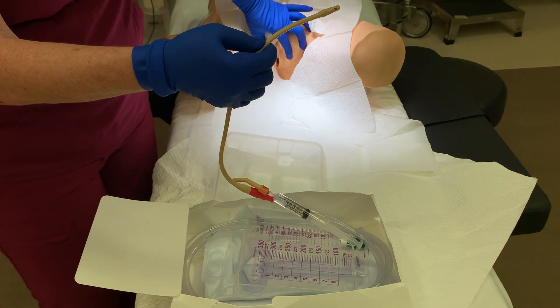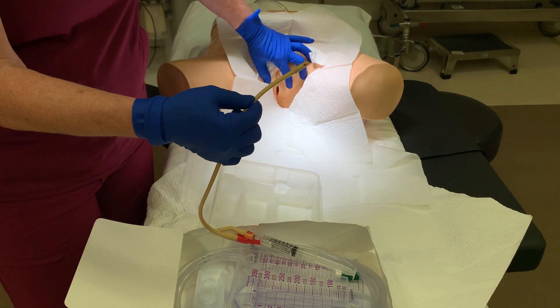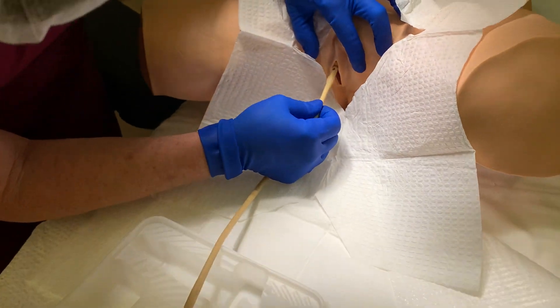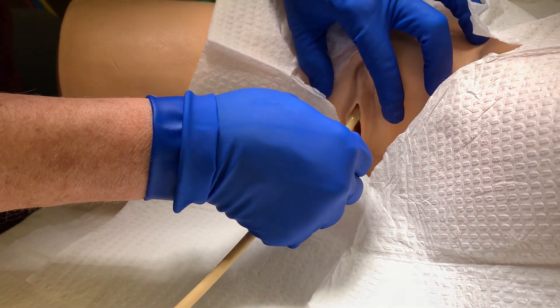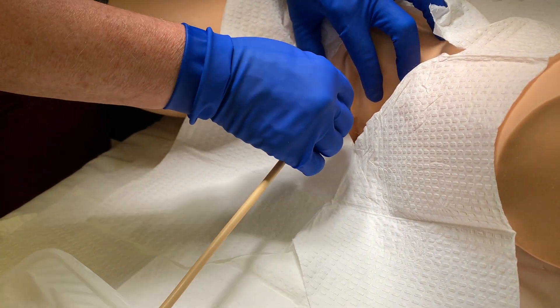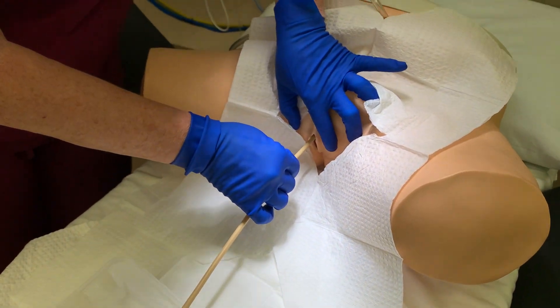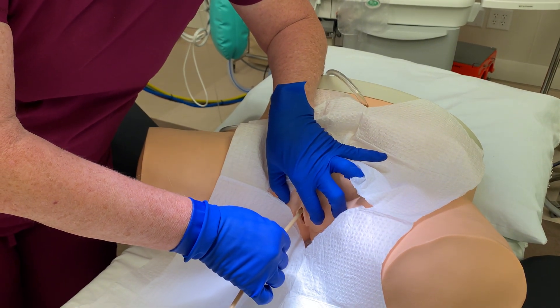My hand does not move. The next thing is to advance the catheter. The female urethra is shorter than the male, so you only need to advance this catheter about two or three inches. I have lubed up the tip of this catheter and now I'm going to place it in the urethra and advance it two or three inches or until I see urine in the tube. If you don't see urine, without moving your hand that is retracting the labia, you can simply use your forearm to lean on the bladder to see if you are in the bladder and advance the urine.